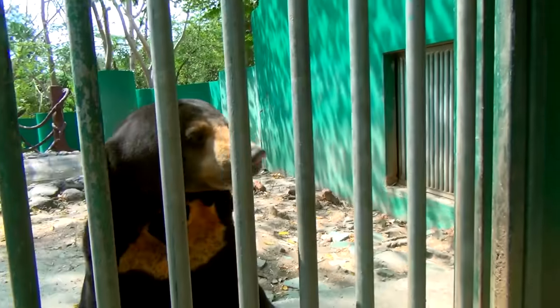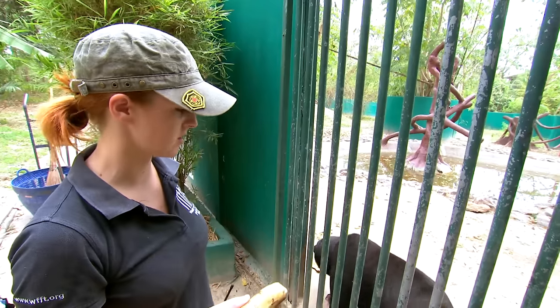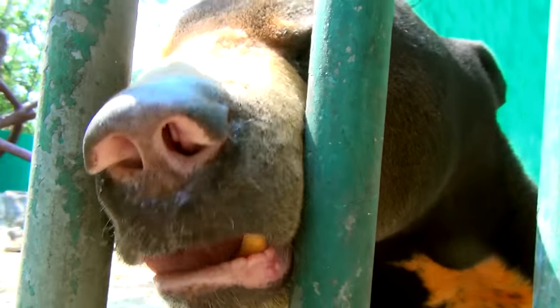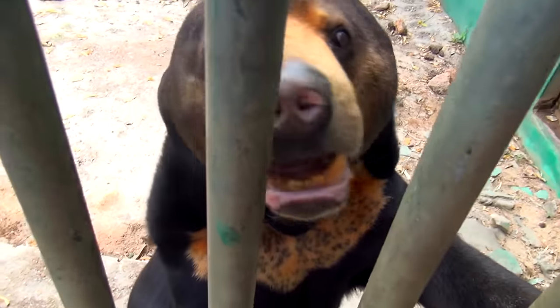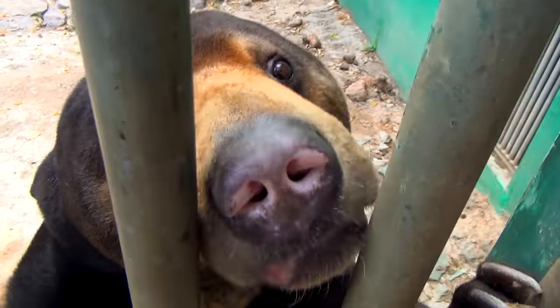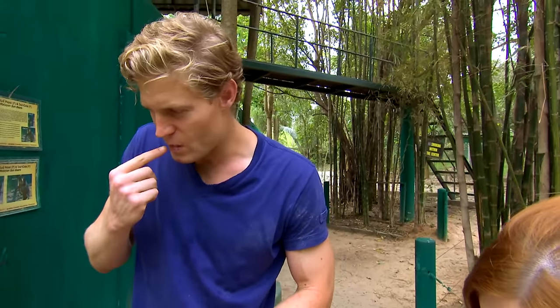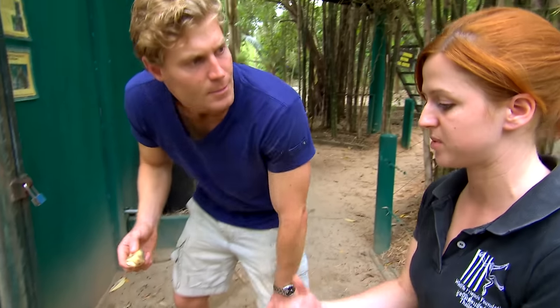Pepsi was rescued from a temple and looked after by monks, and as is often the case, had a terrible diet before she came here. The fact she had a poor diet meant that her teeth just never really have been in good shape. Since she's come in here, she's had a long history of dental problems, and today we're determined to make sure there's no serious issues in there. Every now and then, I do just get a little glimpse of those discoloured teeth. Just the brown coating, the lower canine looks quite dark as well. And we want to catch it before it turns into a full abscess and then the bear can't eat.